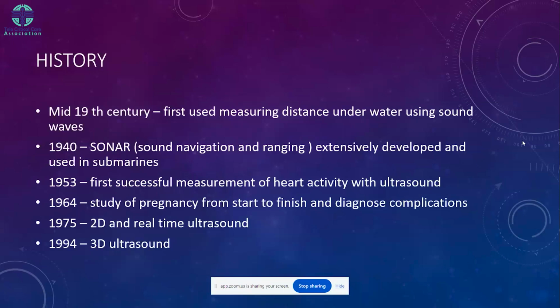A decade later, the whole study of pregnancy, right from the beginning to the finish, was done, and it was also used to diagnose the complications associated with it. In 1975, this became a two-dimensional and real-time technique with the advancement of technology. And in 1994, we started using 3D ultrasound.